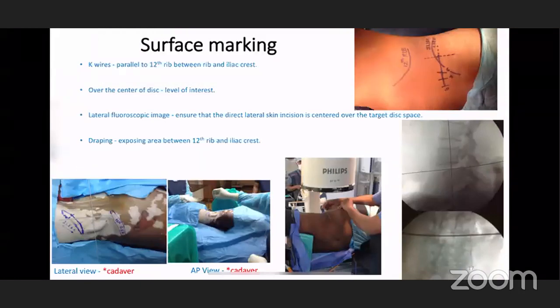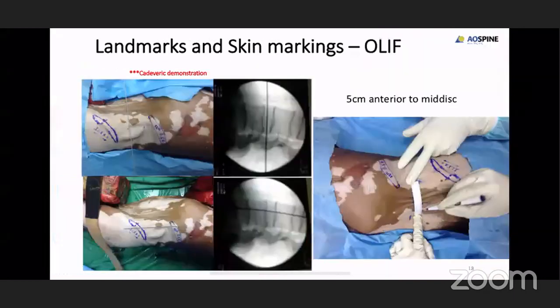Repeating the surface markings: you mark the 12th rib and iliac crest first and take an X-ray in the lateral view as if you are doing XLIF. The guide wires have to be placed exactly at the center of the disc space. You can see in the fluoroscopy image that the guide wires are at the center of the level of interest where you are operating. Once the level is confirmed, mark the level as if you are doing XLIF. The tip of the scale shows the exact marking taken on the C-arm in lateral view.